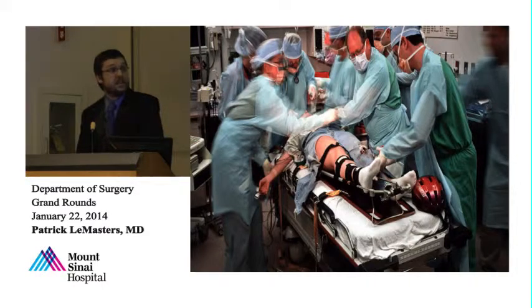And indeed, the General Surgery Board in Germany has required certification of ultrasound skills for their surgeons since 1988. Since about the mid-1980s in America, we began using ultrasound for trauma. And indeed, it has all but replaced the DPL. And then FAST has been included in ATLS training since 1997.